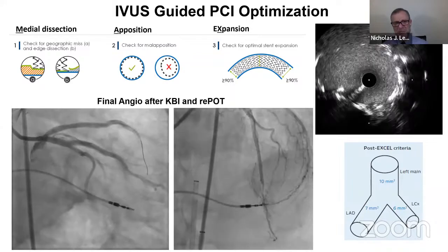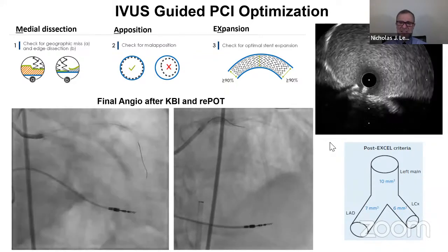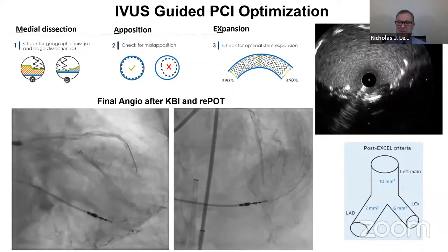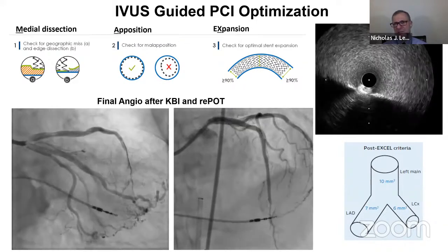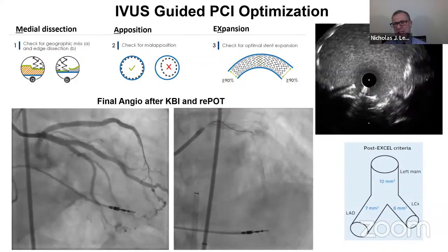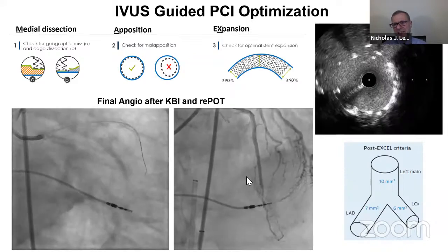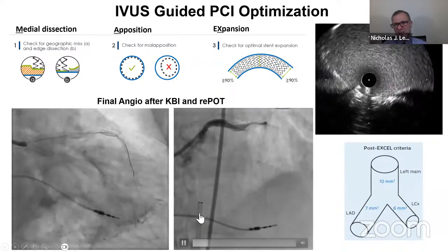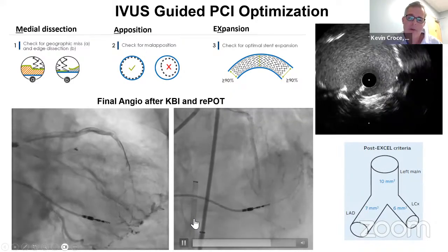Yeah, that's because, from a theoretical basis, if you didn't have a high radial strength stent, a culotte stenting technique might be better in that proximal segment to give you two overlapping stent layers in the left main with the calcified nodule. You'd have more stent radial force possibly and fewer open struts, versus doing a DK crush in that. It's just kind of a theoretical question that I don't have the answer to. Yeah, at least where it's double scaffolded in the left main.